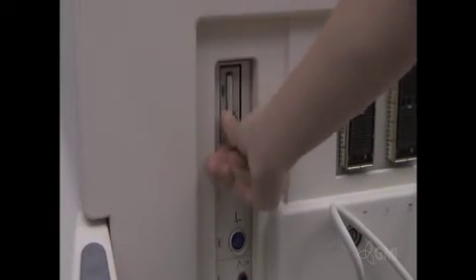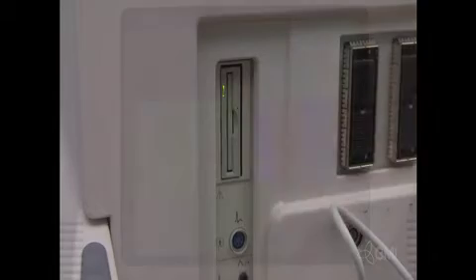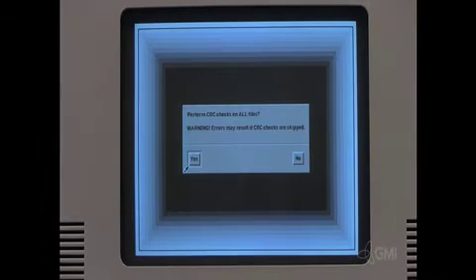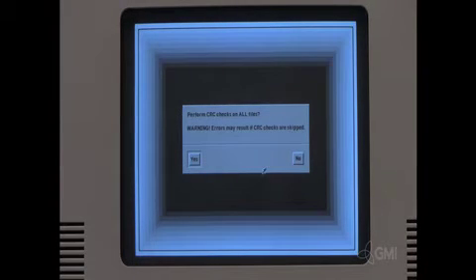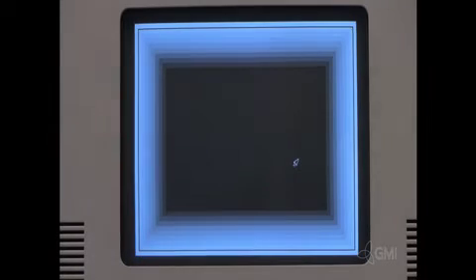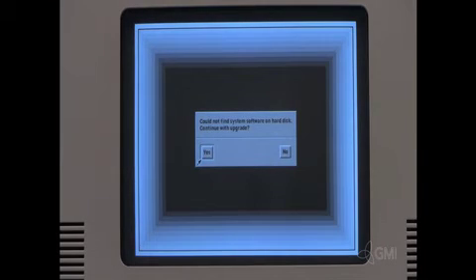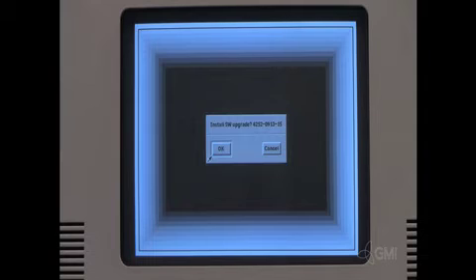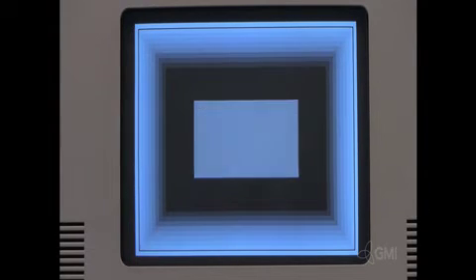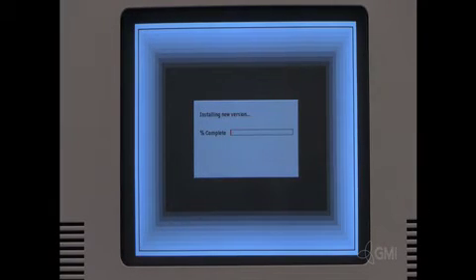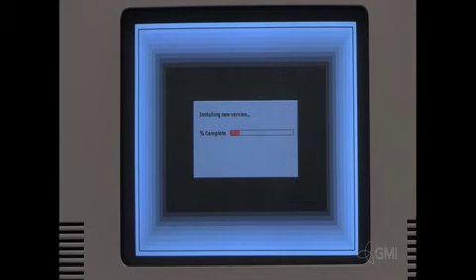Install the software disk and turn the system on. Select no as CRC checks are done during installation. Select yes. Select yes. Select ok. The software installation will begin. This process takes approximately 20 to 30 minutes.